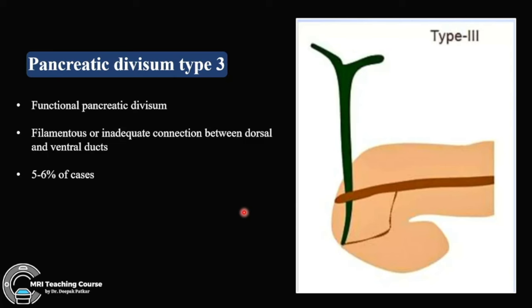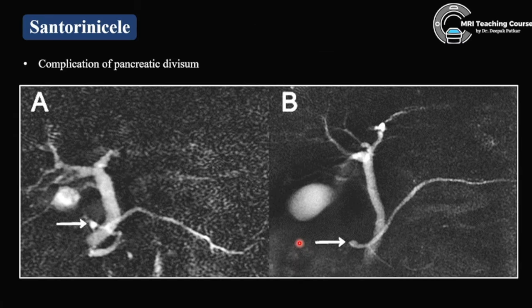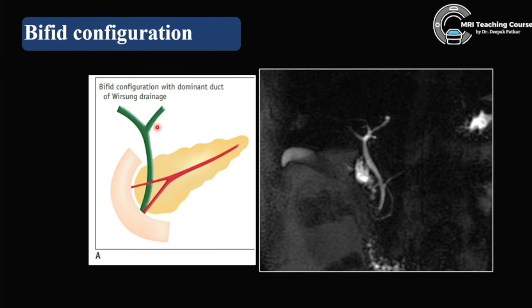Pancreatic divisum type 3 is functional pancreatic divisum — a filamentous or inadequate connection between the dorsal and ventral ducts. You can see that filamentous communication between the two ducts. A complication is Santorinicele, which is dilatation at the minor papilla — always look at the minor papilla to see whether it is dilated.